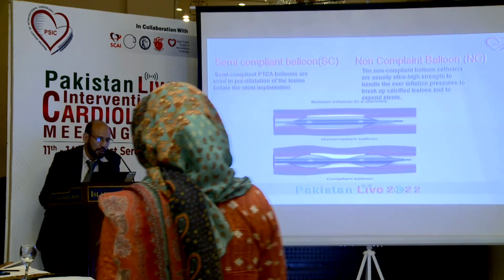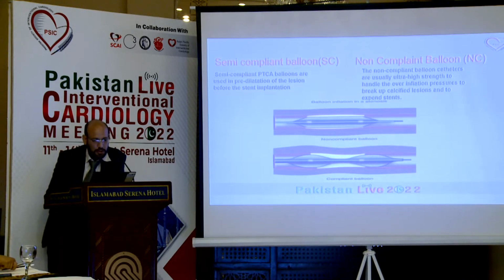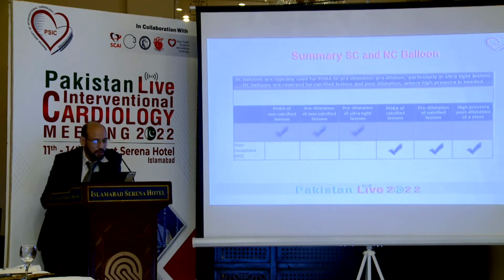So balloon. Semi-compliant balloon, PTCA balloon, are used in pre-dilatation of the lesion before the stent implantation. Non-compliant balloon catheters are usually ultra-high strength to handle the overinflation pressure to break up calcified lesion and to expand stents. So summary of NC and SC balloon.